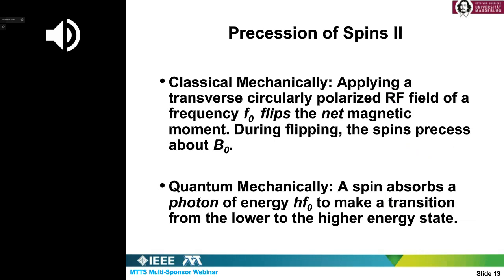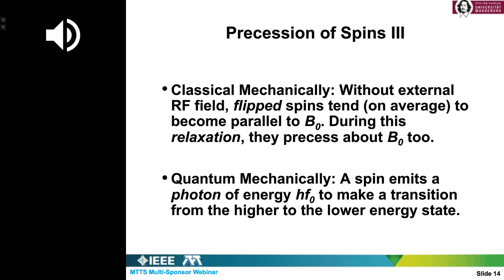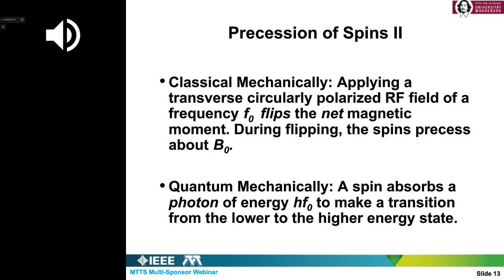This view graph here shows you how to describe the absorbing or emitting of energy, either classical mechanically or quantum mechanically. The last one was for absorbing, which inverts the population.